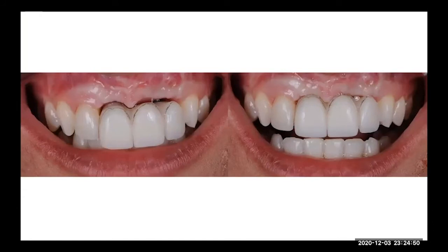So this is our try-in. Before, we normally use press technology. So we wax everything before press. This is our case.